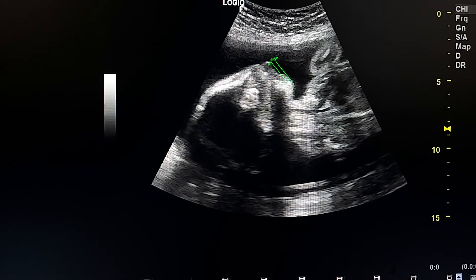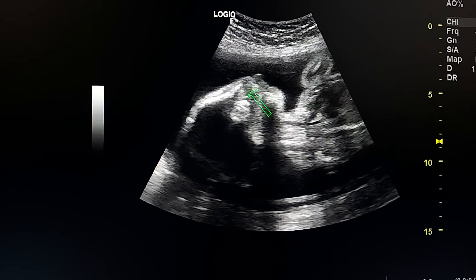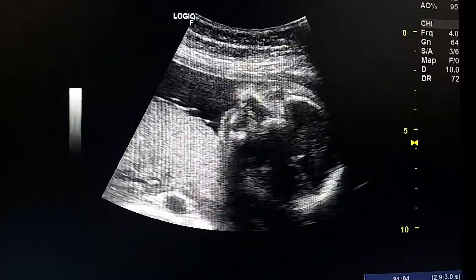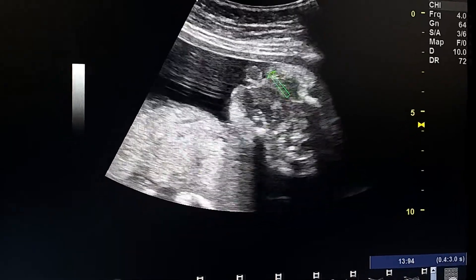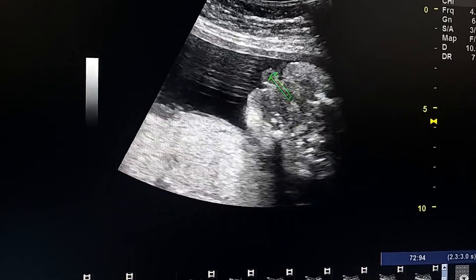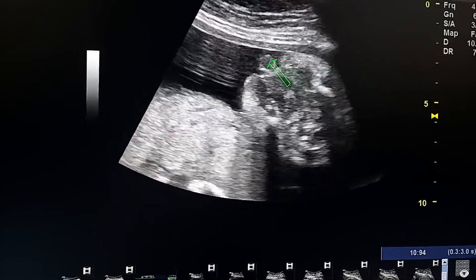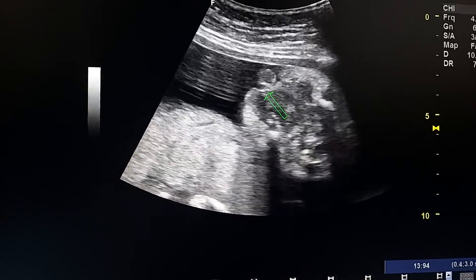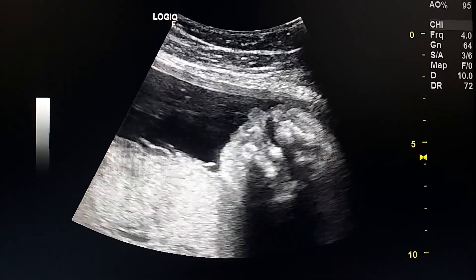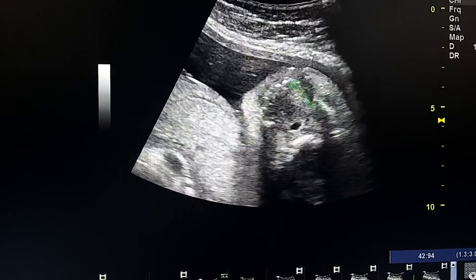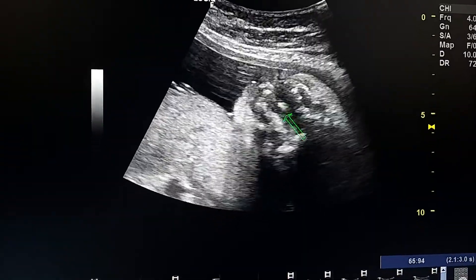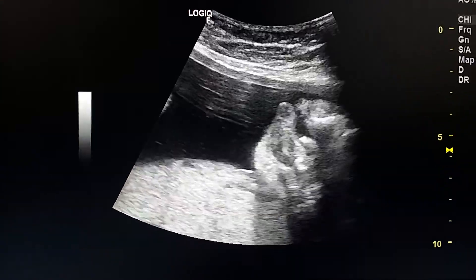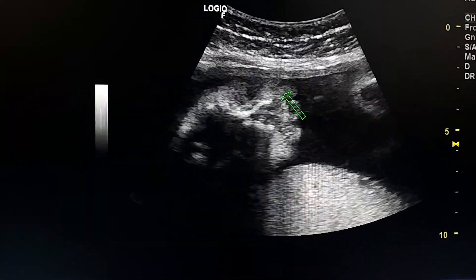Here we see protrusion of the anterior maxillary area. This is the profile of the fetus. This axial view of the upper lip confirms bilateral cleft lip. This is the mid portion — the philtrum of the upper lip — and this is the defect on the right, and this is the defect on the left portion of the upper lip. This is the maxillary area and this is the palate, which is clefted.